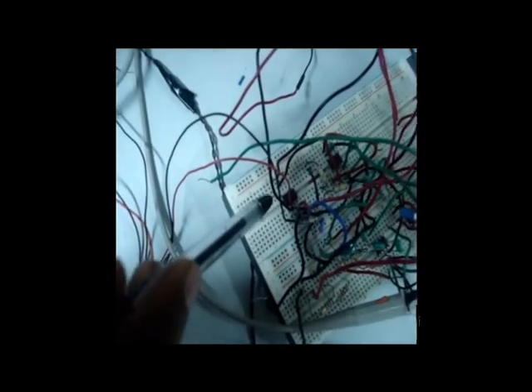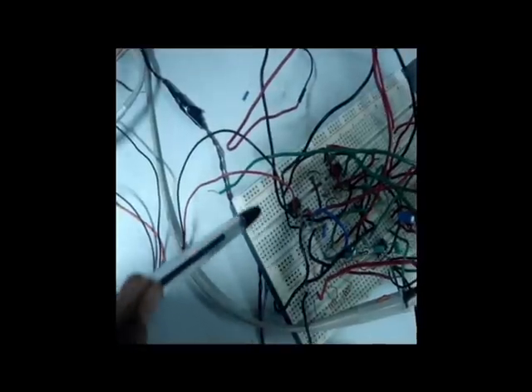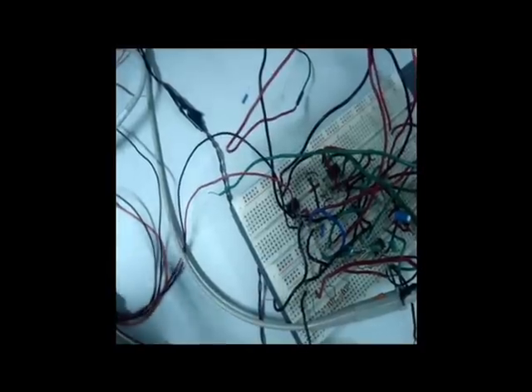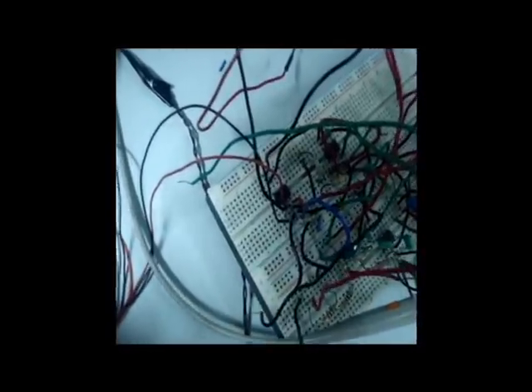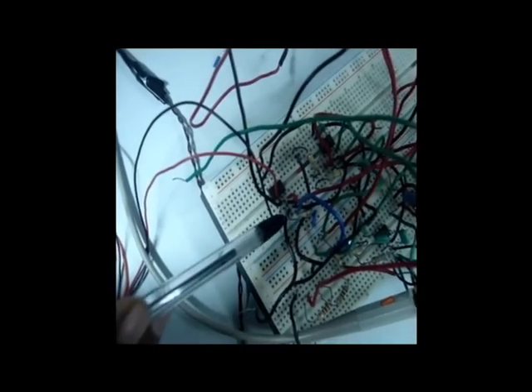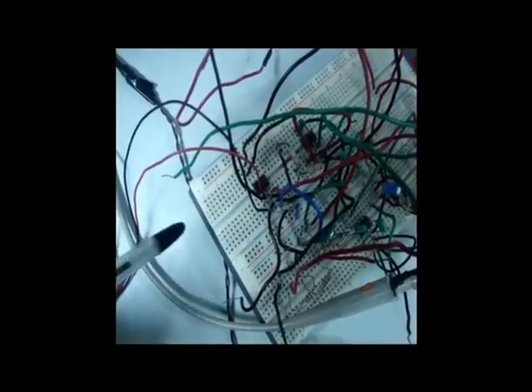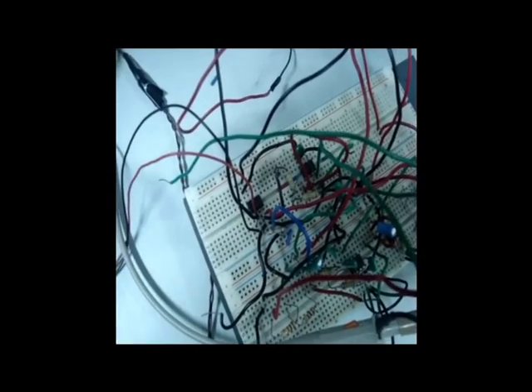Now this output is amplified by a transimpedance amplifier which is built around an LM392 op-amp. We put a feedback resistance of 1 megaohm. We chose the LM392 op-amp because the output current of the photodiode is very small and it has a very low bias current. The output of the transimpedance amplifier is around an 8 to 12 millivolt AC signal plus some DC offset. From this stage onwards we begin a filtering process.